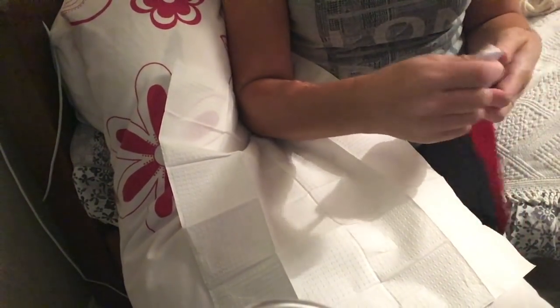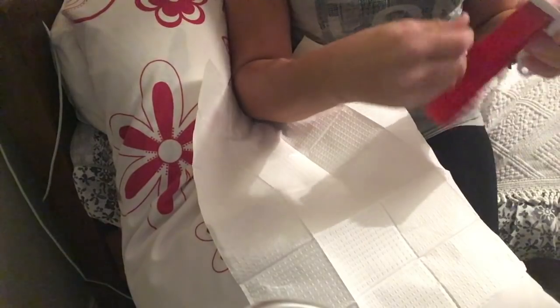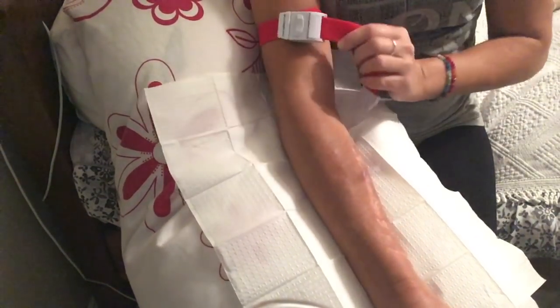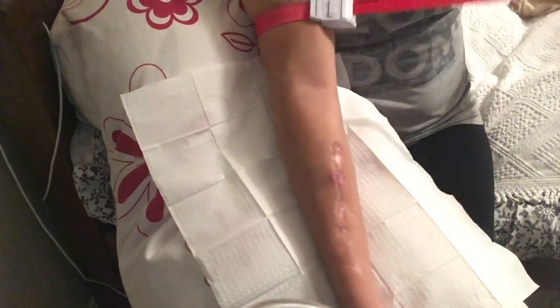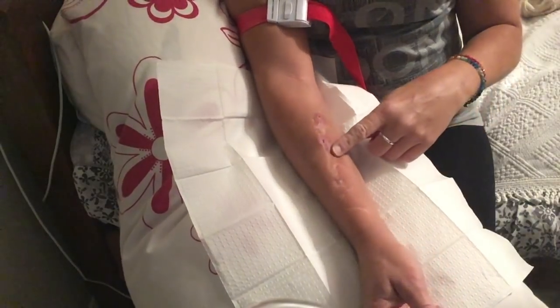What I really want to show here is how you can needle and tape and connect up completely one-handed. You can do this on your own — you don't have to have someone with you helping. I've always needled myself and done the whole thing without extra help. First of all, I just put the tourniquet on my arm and tighten that up. With needling, I always start with the lower needle, the arterial.